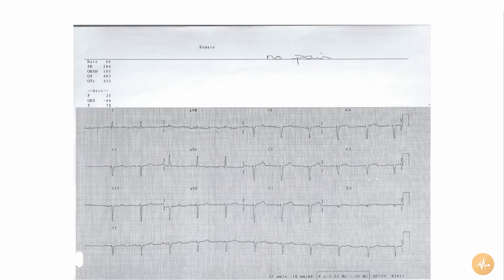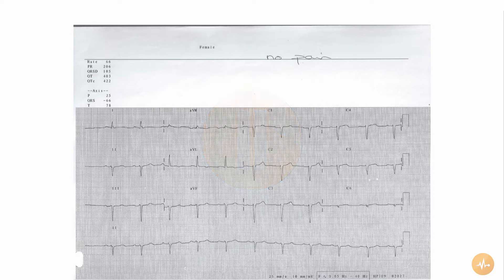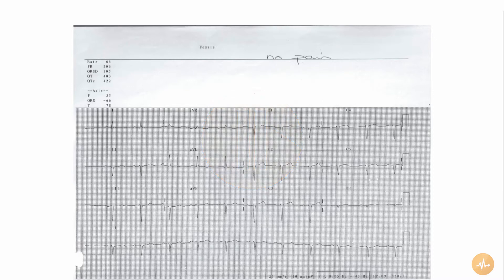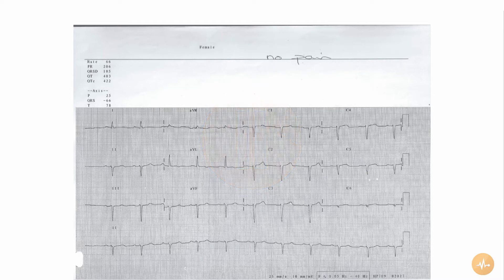This is the 12-lead ECG of a patient who's had a sustained episode of chest discomfort. Pause this recording now and interpret the ECG on your own before pressing play again to hear me interpret the ECG.